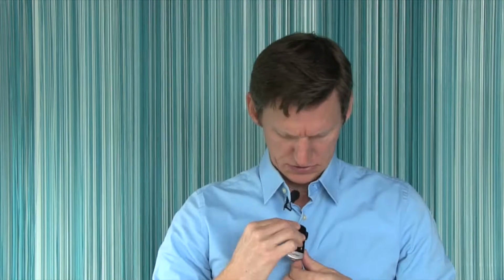So if you wear the phone clip in the center, you need to turn the clip to the side and clip it to your shirt just like that, and it shouldn't be an issue. But if you need to wear it over on this side, and it's farther to this side, then you need to point that phone clip at your mouth so that the signal is picked up best through the microphones on the phone clip. So the orientation of the phone clip does play a role in the sound quality to the person on the other end that's listening.